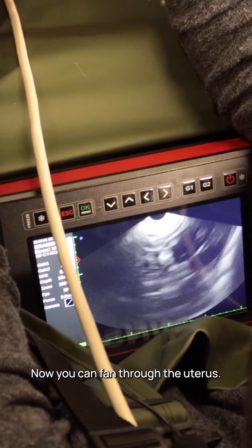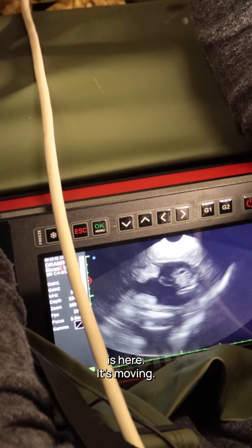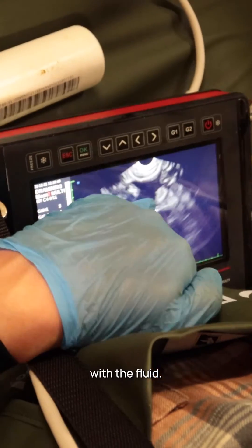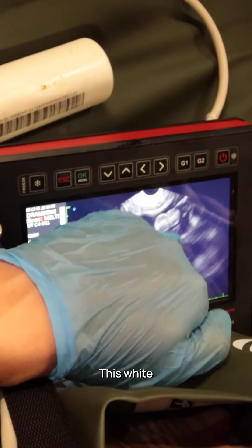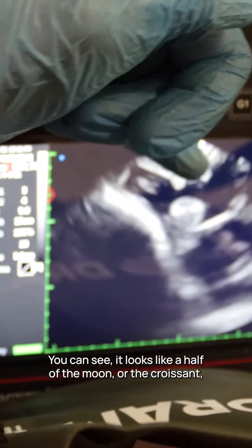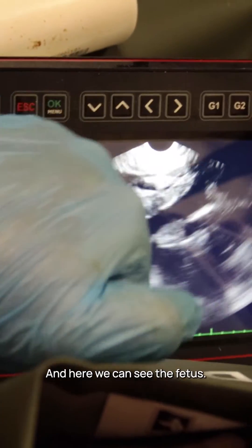You can fan through the uterus — you can see the cotyledons and the fetus is here, it's moving. The uterus is filled with fluid; fluid is black. These white round shapes are cotyledons, which are part of the placenta. It looks like a half moon, a croissant, or a donut depending on the view.